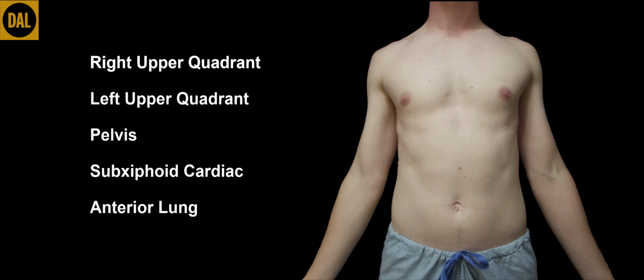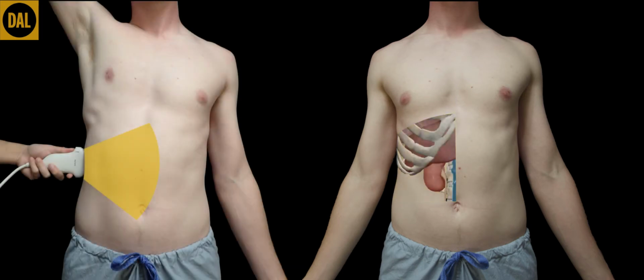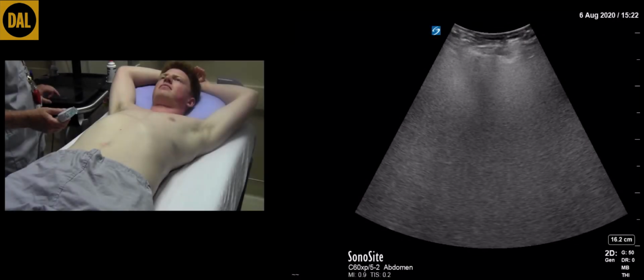The eFAST scan starts with the right upper quadrant view. The transducer is in the coronal plane. The initial depth should be set appropriate to patient body habitus.